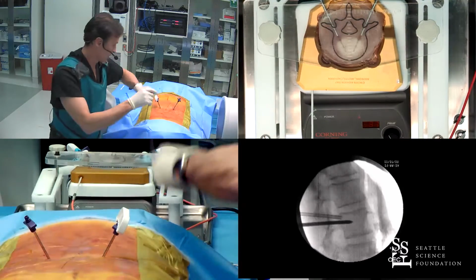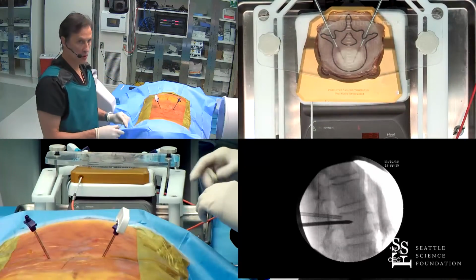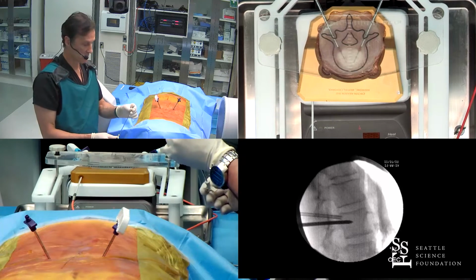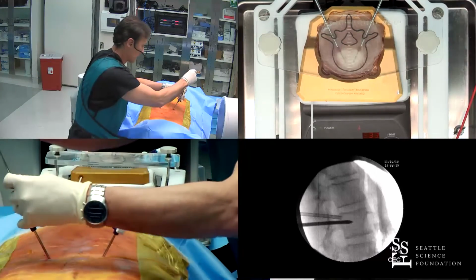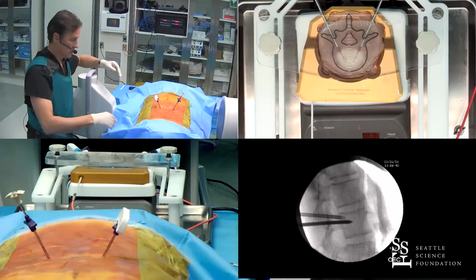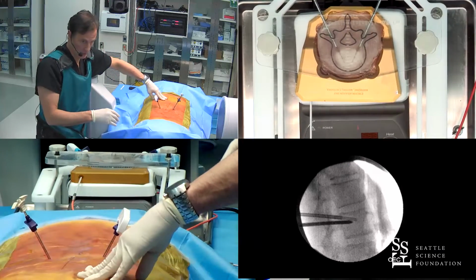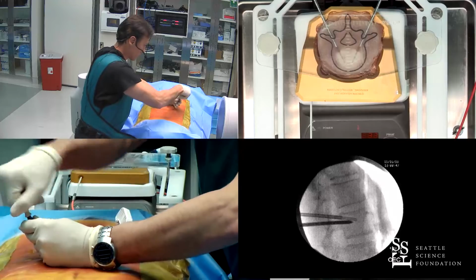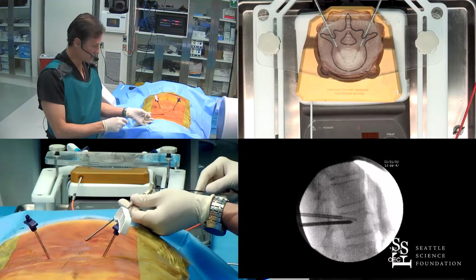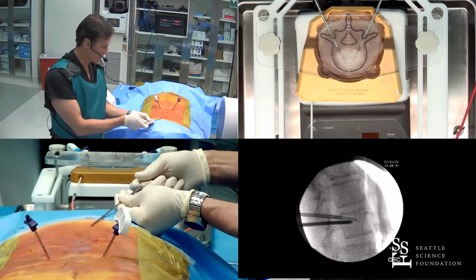Before I drill, if you're dealing with a tumor, the thing that you want to do is a biopsy. This is a biopsy needle. This is a Francine type tip. It's bibeveled and it has tines on the end. This is what it looks like when you go in to do a biopsy, and you'll just advance it similar to a drill. This is a very nice cutting device. You can feel the bone being taken up. We'll have the biopsy cannula, and the stylet will push out the biopsy, and there it is.